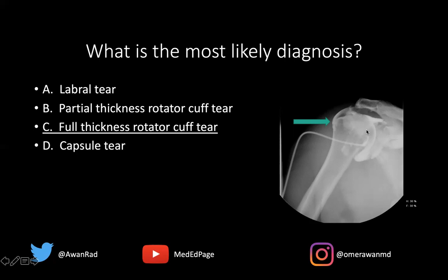A labral tear would be very difficult to diagnose on a fluoroscopic image — MRI would be more telling. The labrum is a 360-degree structure that encompasses the entire glenoid. We would expect contrast to be here or here, but certainly not out in the subacromial region.